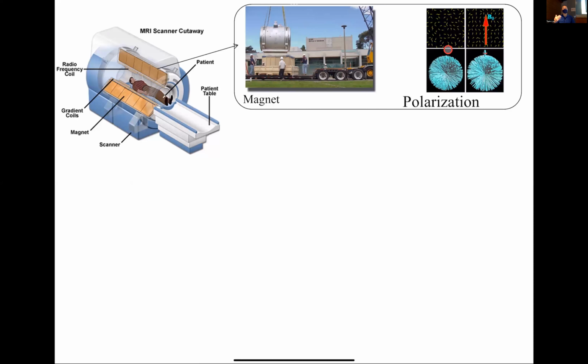If you go to low field, you really need deep learning to help make up the fact that you don't have any signal. If you have enough signal, it helps. Maybe it helps go faster, we'll see later, but it's not as critical. You can still do the job without deep learning, which has been done for the last 30 or 40 years. Okay, so that was what we talked about.